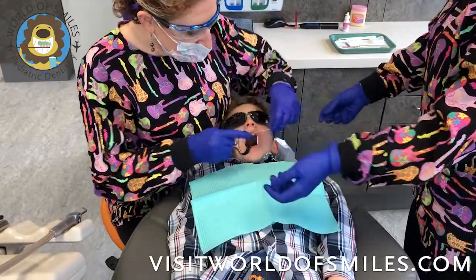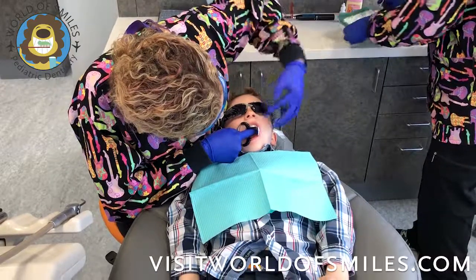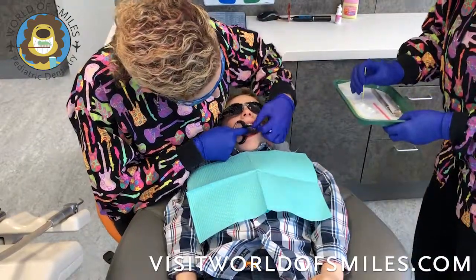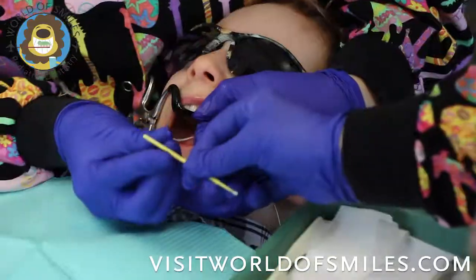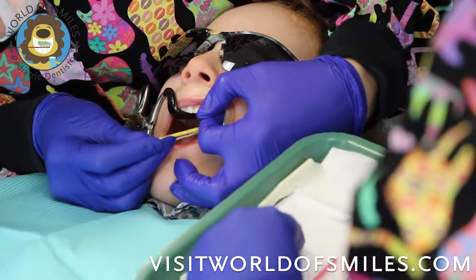And we'll use some super floss since we are addressing an interproximal cavity. Then we'll use a micro brush with some silver diamine fluoride to apply it to the super floss in the area of the cavity.